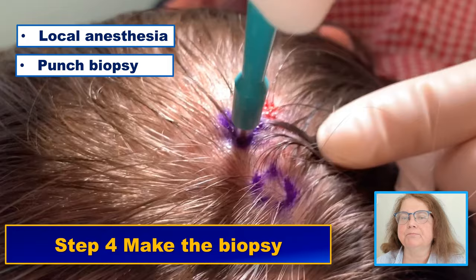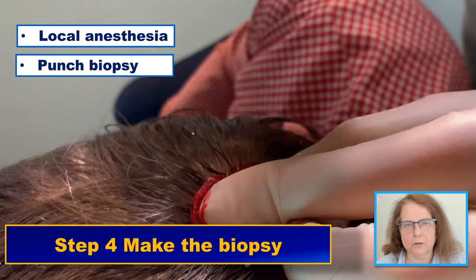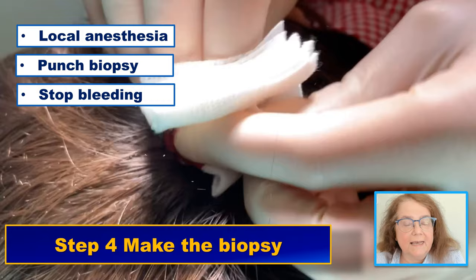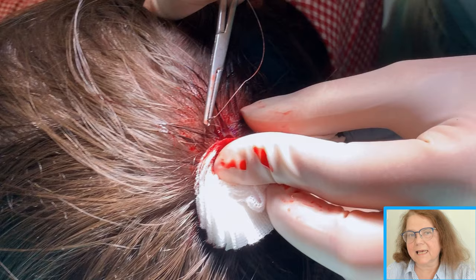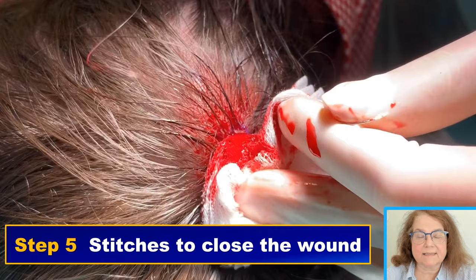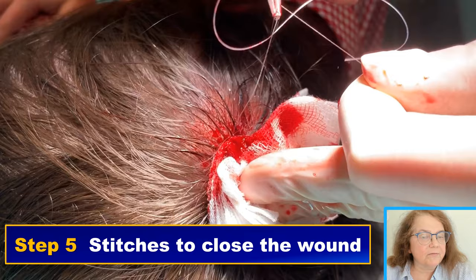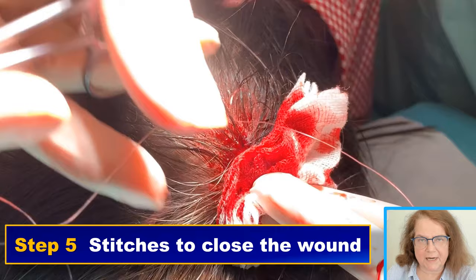We start with local anesthesia, then perform the punch biopsy — two things to remember. First, the biopsy punch should be not less than four millimeters, because a smaller biopsy will not be sufficient for a pathology report. Second, the biopsy needs to be deep enough so that we have all the hair follicles in the sample. We then stop the bleeding. Bleeding on the scalp is usually quite intensive due to the many blood vessels in this area, so if this is your first scalp biopsy, it is good to have somebody there to help. I also recommend using stitches to close the wound after a scalp biopsy.